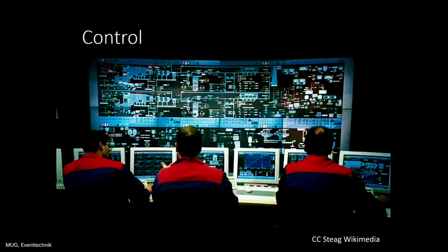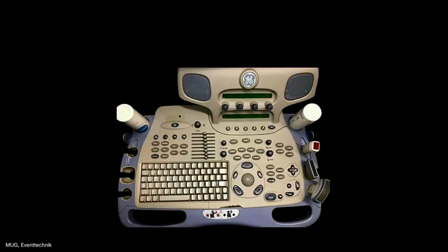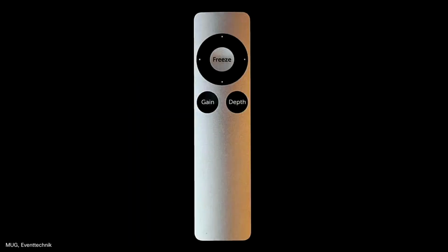Now we come to our control part, because we need to handle our machine. This actually is our machine. Looks quite difficult and always reminds us of the old remote control of our TV. How many of these buttons did you actually ever use? Maybe 3, 4? Good for us, there's an alternative. We only need 3 buttons, basically, to control our ultrasound device.